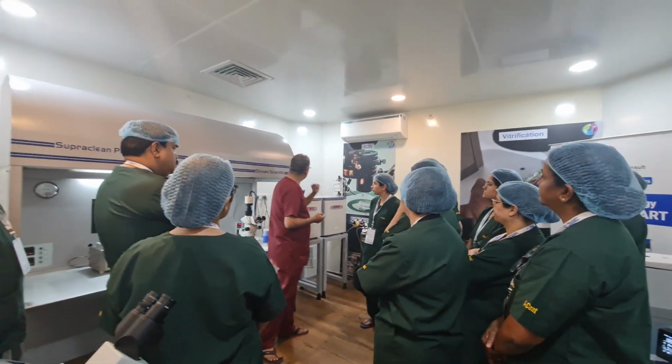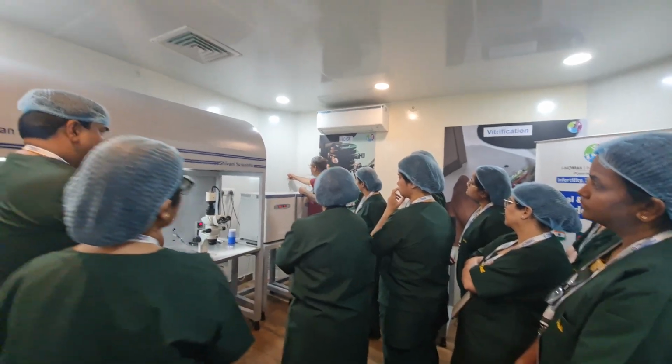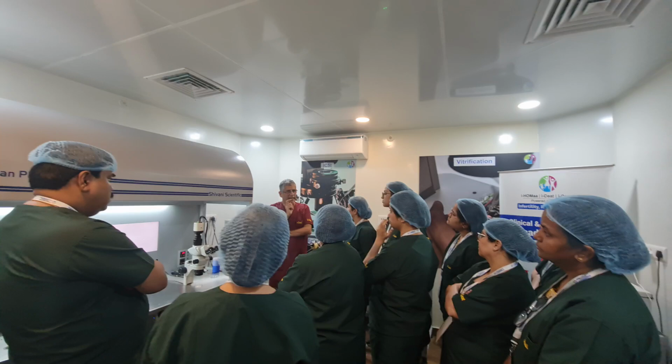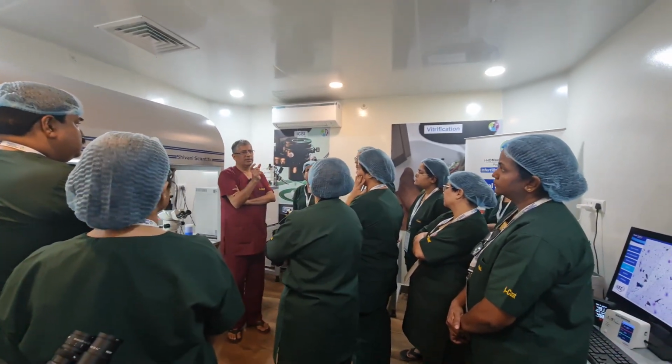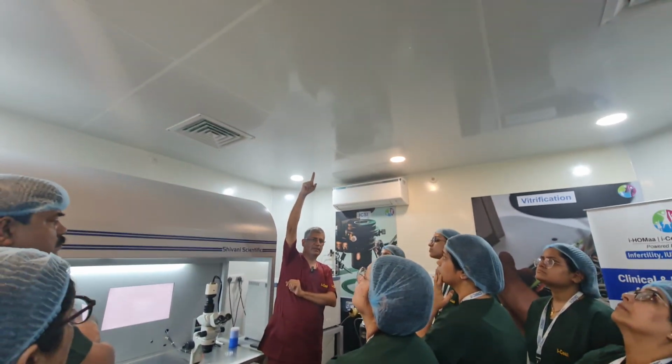So this is one sample you have. This wall which you have here is made up of ACP sheet. It's just a demonstrative wall, or even a modular will look like this. Now the ceiling which you see here is again an ACP ceiling.